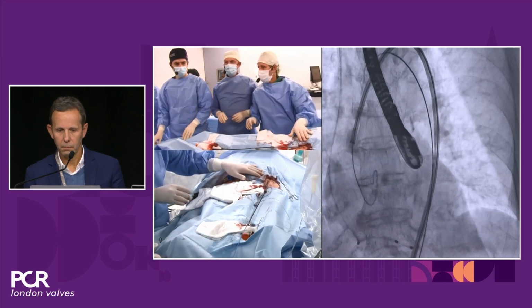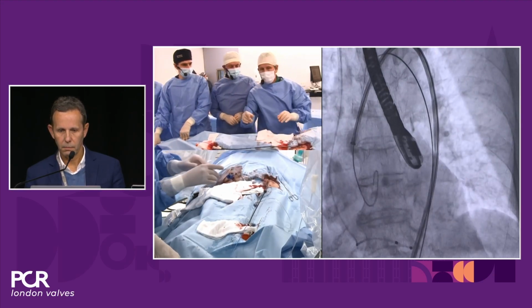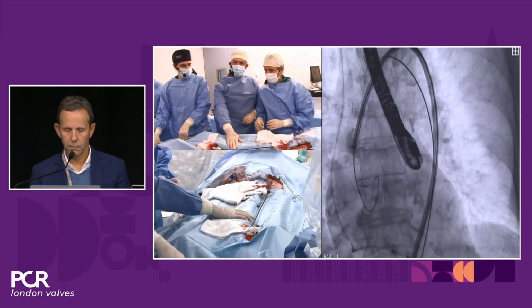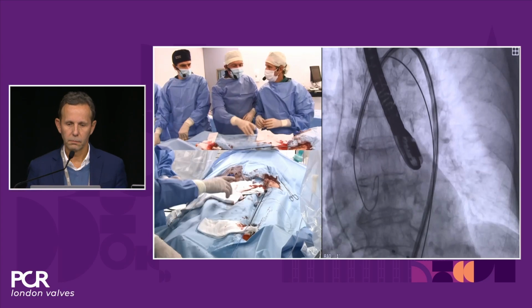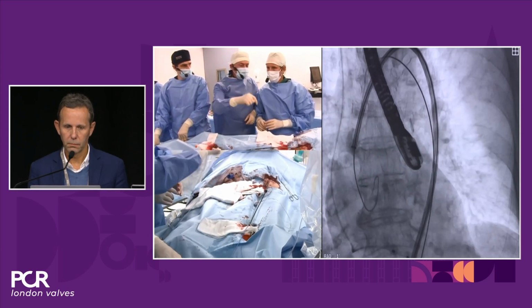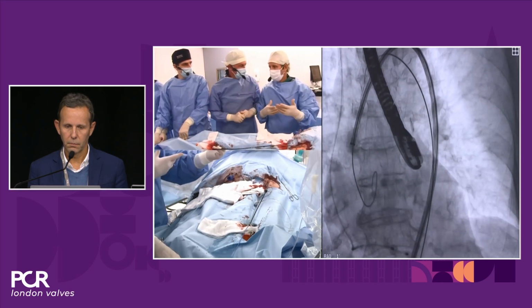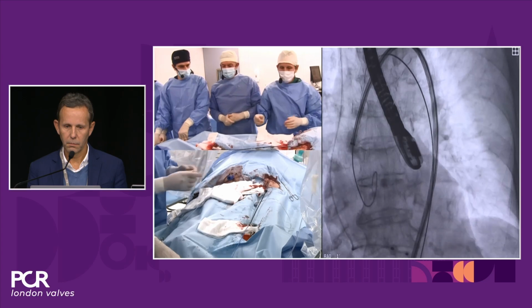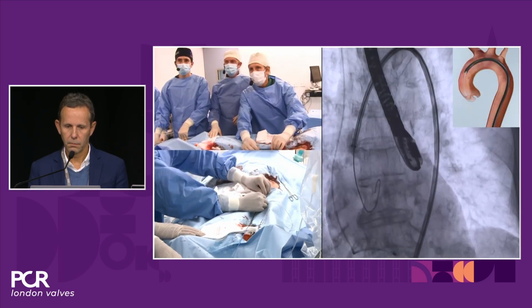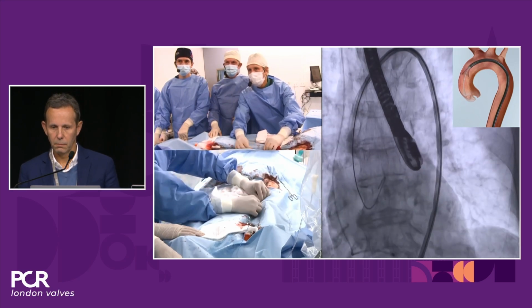So just to remember, Alex, this is a 9.5 French device, and now we are going to deploy the filter, right? Despite the fact that this is a 9 French device, Fabio, I think that the advantage, in one axis, you're going to deploy the Emboliner, but also you're going to leave the pigtail as a reference. So that's going to avoid an additional access, such as radial, for instance, right? Yeah, another radial. So deploying is quite easy. You just pull back the sheath and deploy the filter.